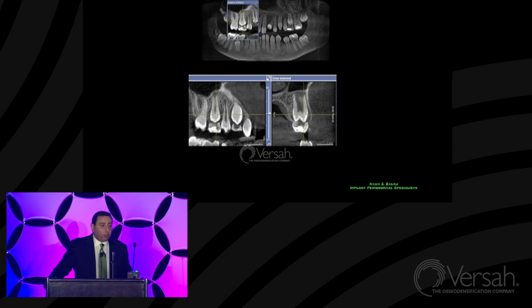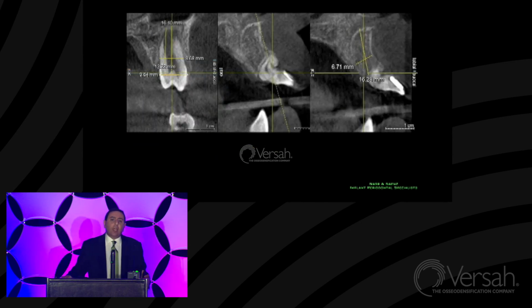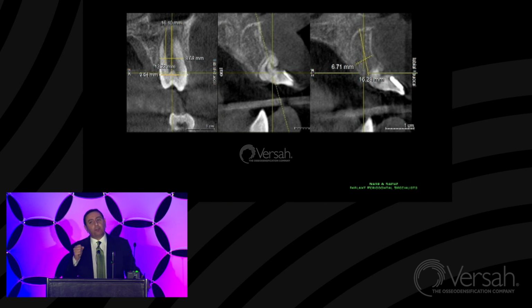Surprisingly, there was good bone, reasonably good bone thickness. There was a little bit of loss of bone height because of the position of the supernumerary teeth, the odontoma and the tooth itself. So I knew I needed to expand the ridge a little bit to get that premolar to fit. It has to be snug, firm, but you can't force it. So it takes a little bit of trial and error with testing the tooth in position.